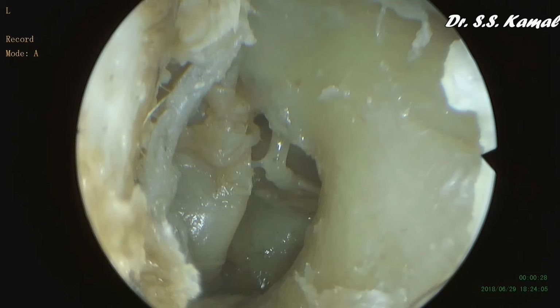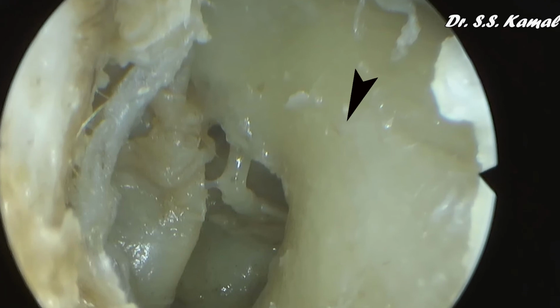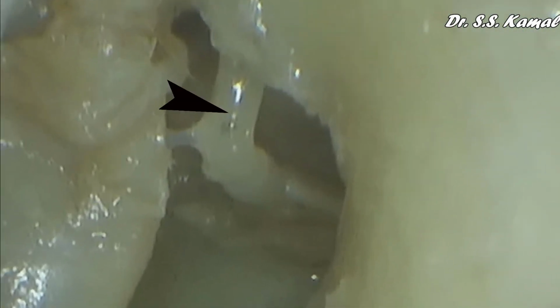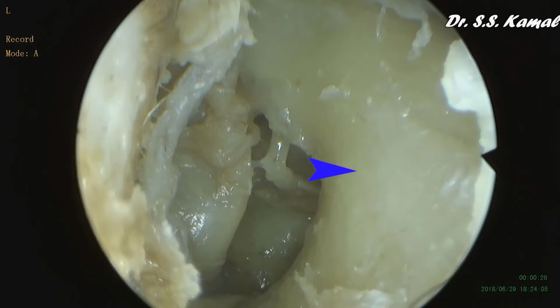In this left ear, after elevation of tympanomeatal flap, we can see the tympanomastoid suture, incus, and stapes tendon. The moving blue arrow beneath the tympanomastoid suture is indicating the initial dissection pathway to uncover the pyramidal eminence. Before starting the next dissection, the chorda tympani nerve needs to be transected.